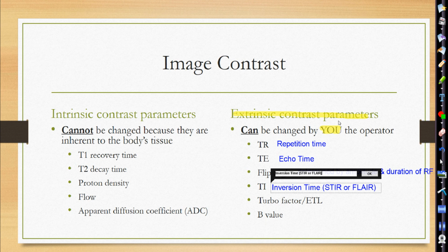Typically STIR is going to suppress signal from fat, and we'll go over this later when we talk about pulse sequences, but just a quick synopsis of what a STIR sequence does. It suppresses fat: it applies an inversion pulse to all the tissues, and then the pulse sequence starts right as our fat recovers up to the transverse plane.